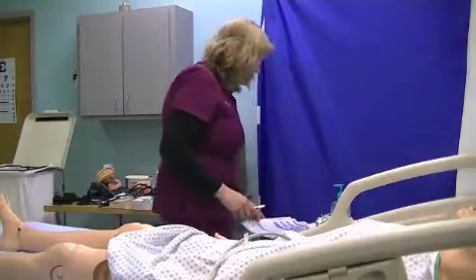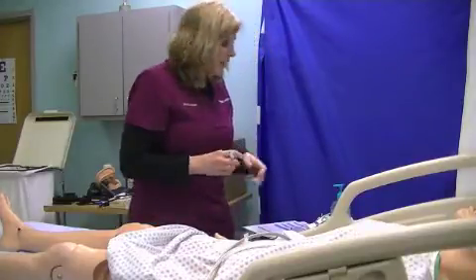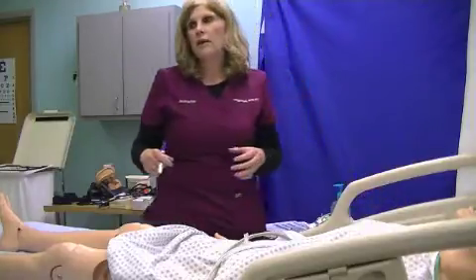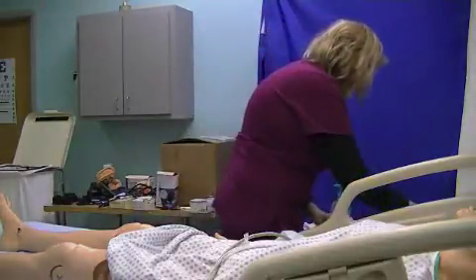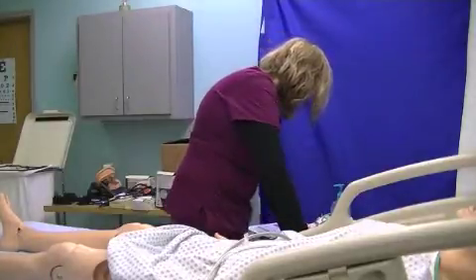Now, Mr. Pierce, your temperature was 99.0. So if they had a little bit of a temperature, and you're going to do any interventions, you would document that you gave them a cool rag across the back of their neck or across their forehead, however you want to do it. And we're going to document the temperature.